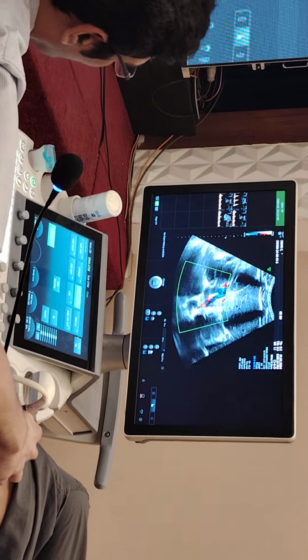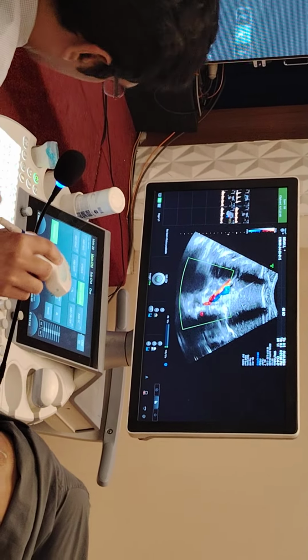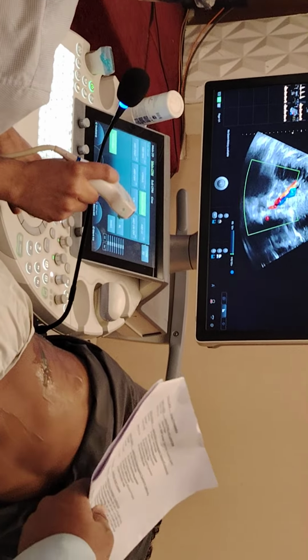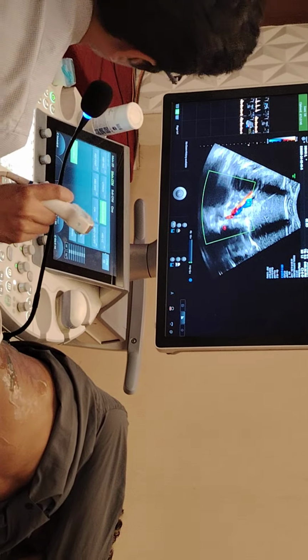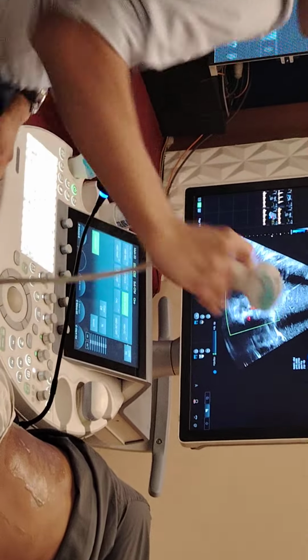Okay, but I hope all of you got a bit. Relax. Okay, so this is almost the entire length of your renal artery, right? This is your aorta, your origin coming up over here, your mid segment, and your hilum. If you have any kind of narrowings coming up over here, you should be able to identify that as well, right? So I think I've covered whatever there is in renal artery.